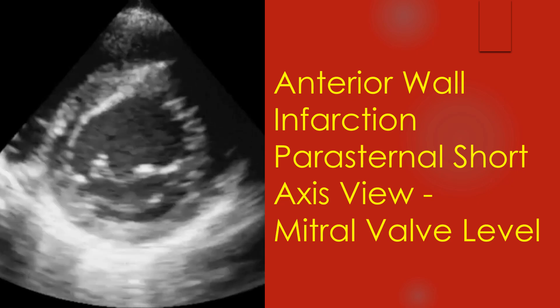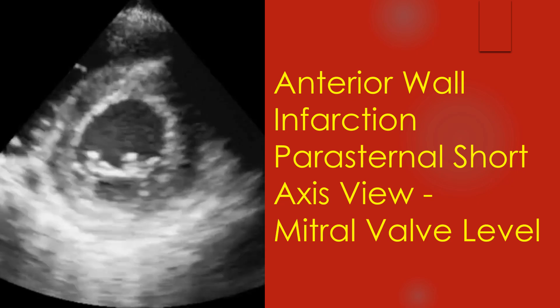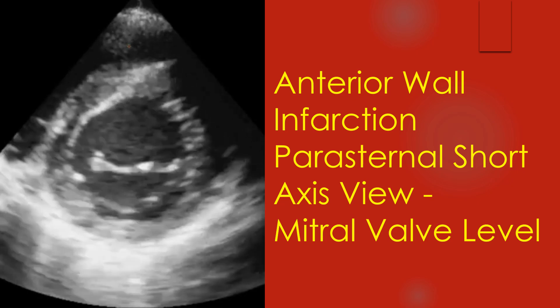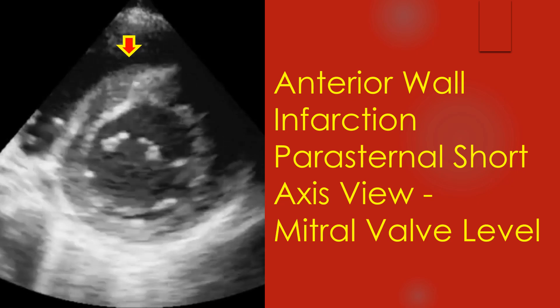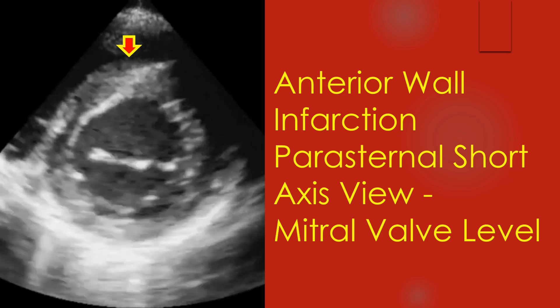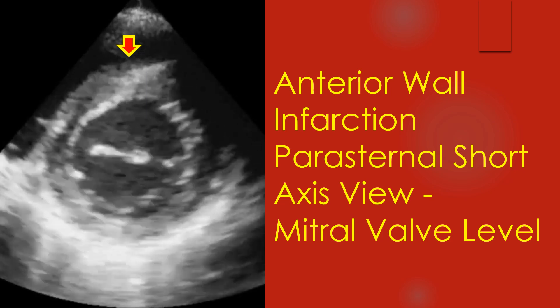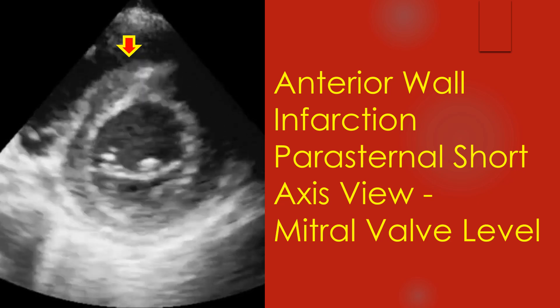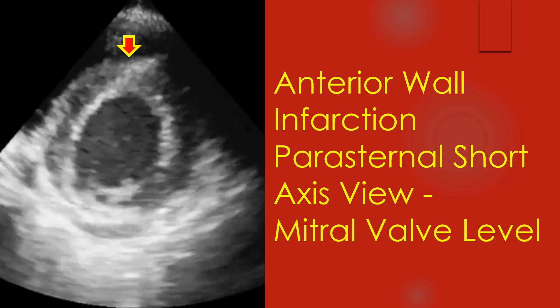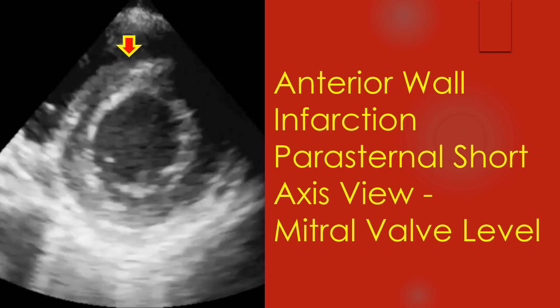Parasternal short axis view showing severe hypokinesia of the basal anteroseptal segment. Other segments at the mitral valve level are basal septal, basal anterior, basal lateral, basal posterior, and basal inferior.